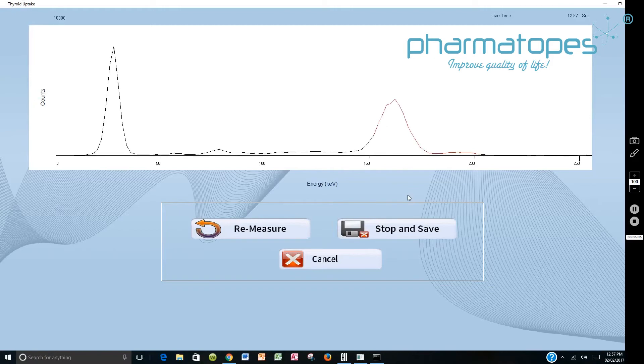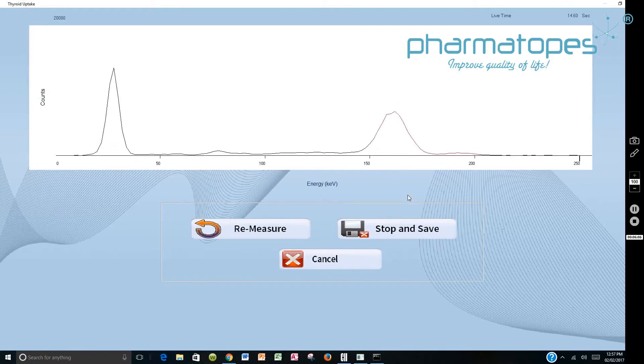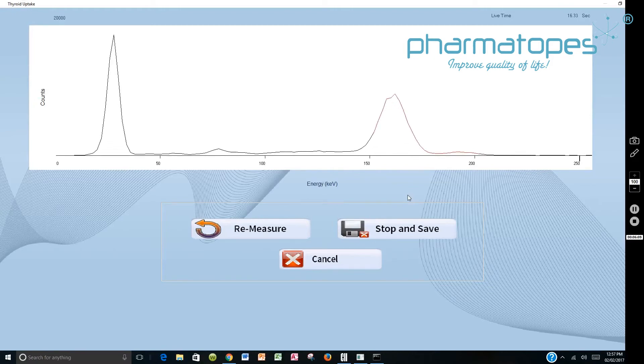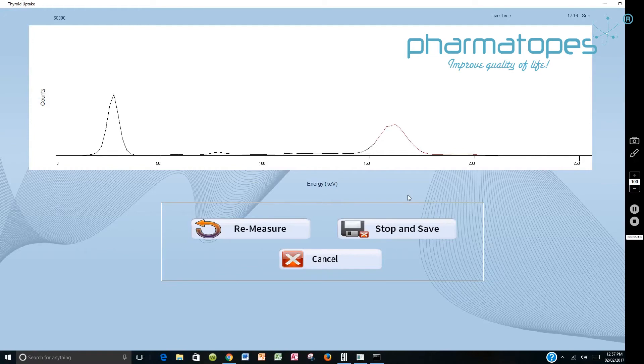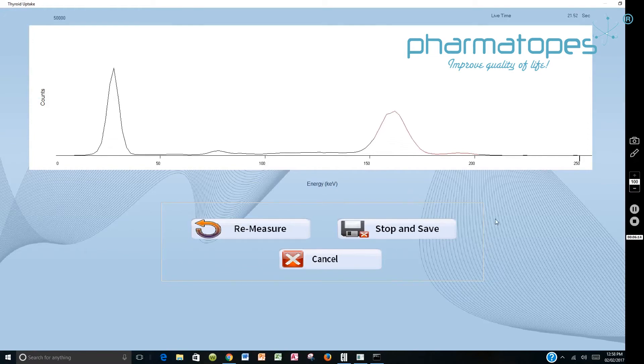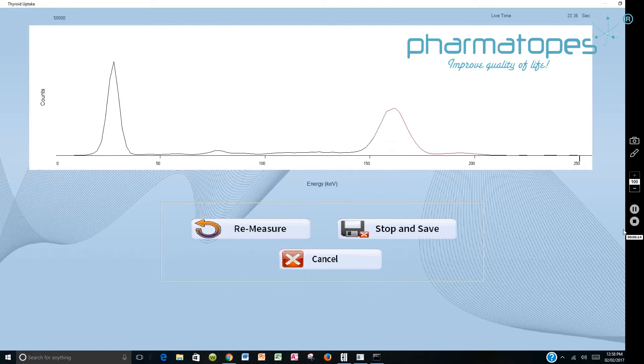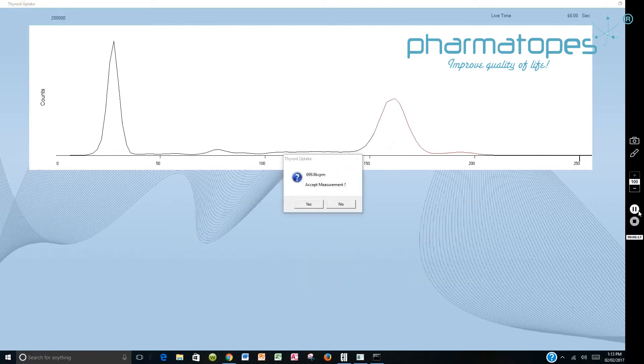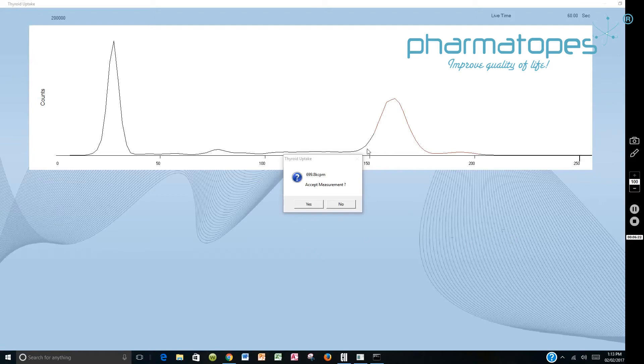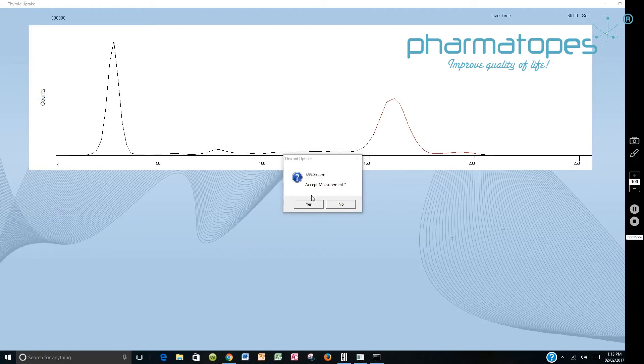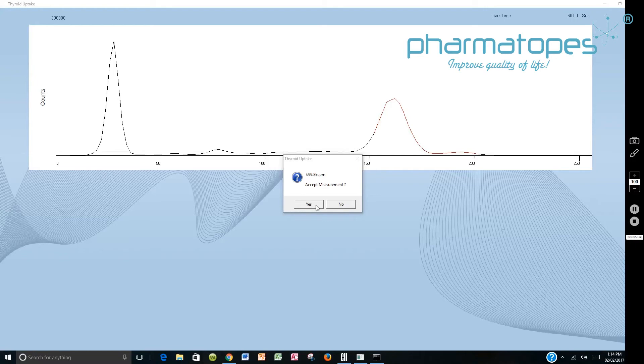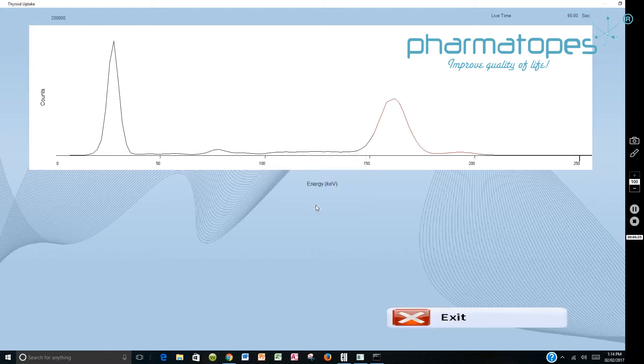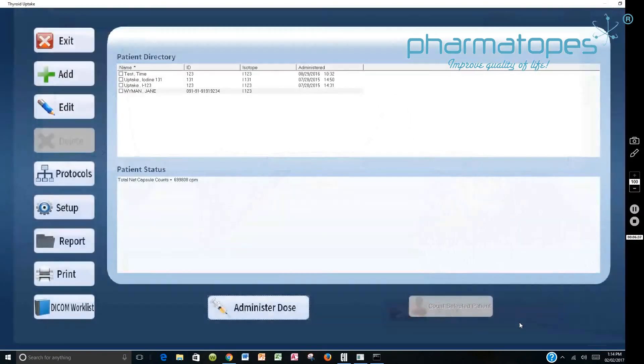And as it does this count, you'll see the spectrum come up. And it'll count this capsule for one minute. Once the capsule count has completed, you'll get a readout for the total number of counts. And you have the opportunity to accept the count. So just make sure you check the spectrum. And it should be a reproducible count from day one, day two, day three, if you're counting pretty much the same activity. Once you've done that, you can say exit.